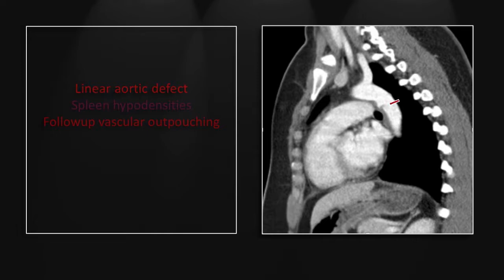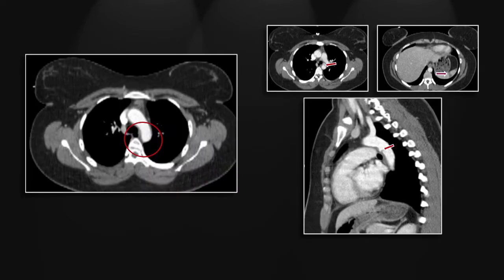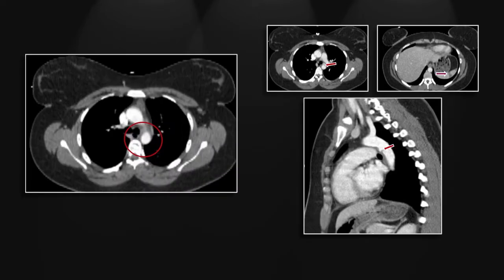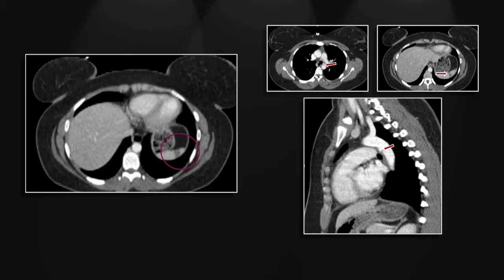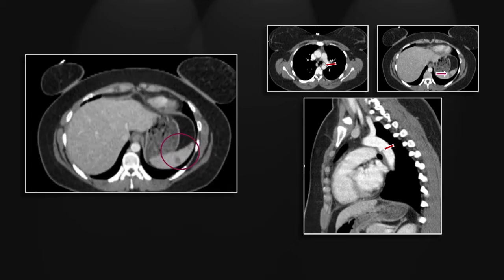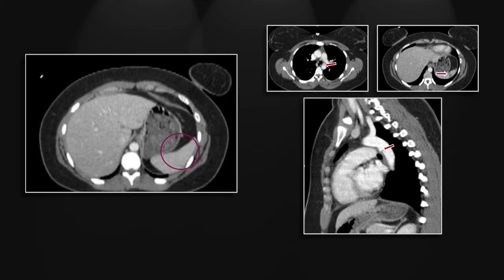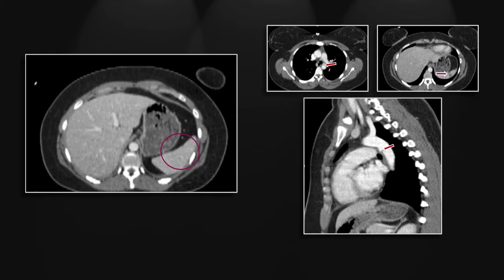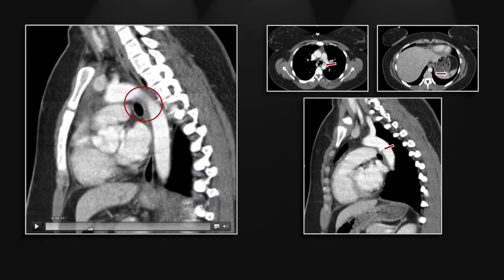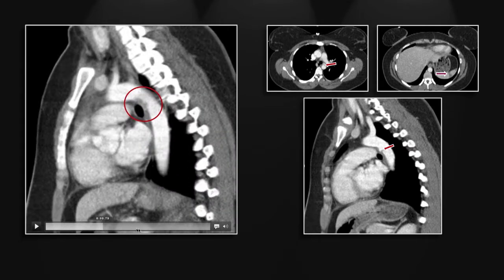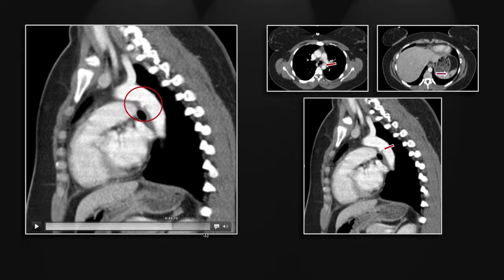Here on the sagittal, you can appreciate the intimal flap and a small pseudoaneurysm. Here is the irregular defect on axial and another view of the splenic hypodensities. Note the lack of perisplenic fluid. The sagittal CINI gives a nice view of the intimal flap and small pseudoaneurysm.